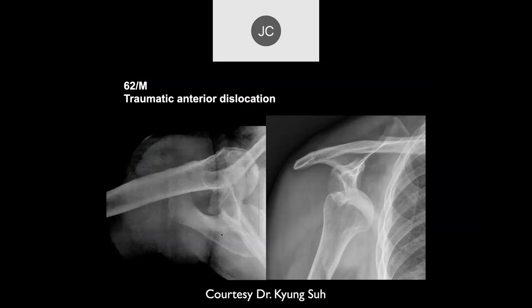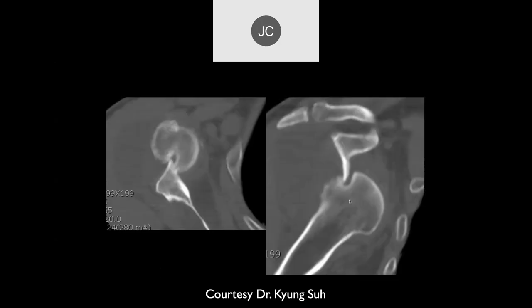Looking at this case — definitely abnormal. We have an anterior inferior dislocation of the humerus. You can see the mechanism of injury: the anterior dislocation of the humeral head, the muscles bang it back against the anterior inferior glenoid, producing the Hill-Sachs injury here on the plain film. This usually occurs with an outstretched arm — the patient falls and supports themselves with an outstretched arm.